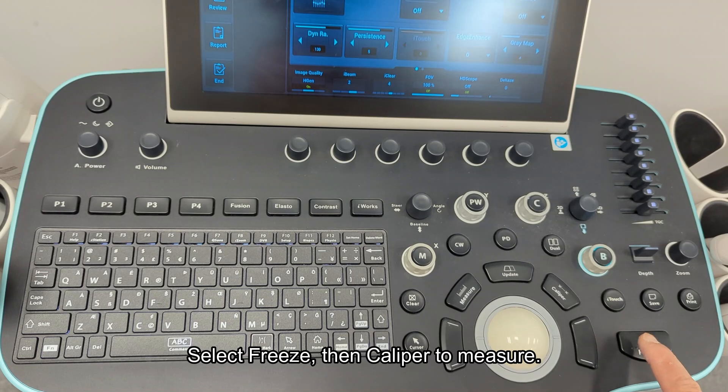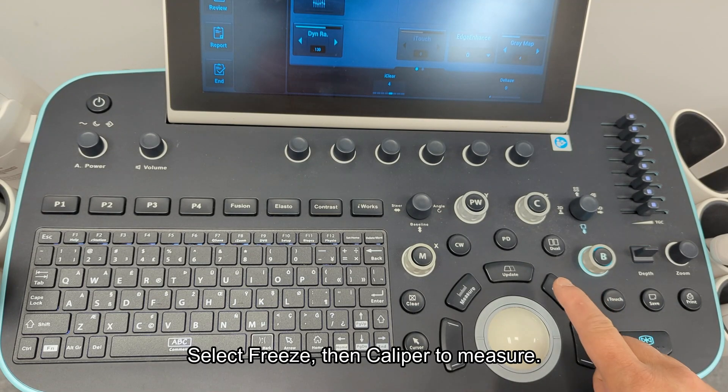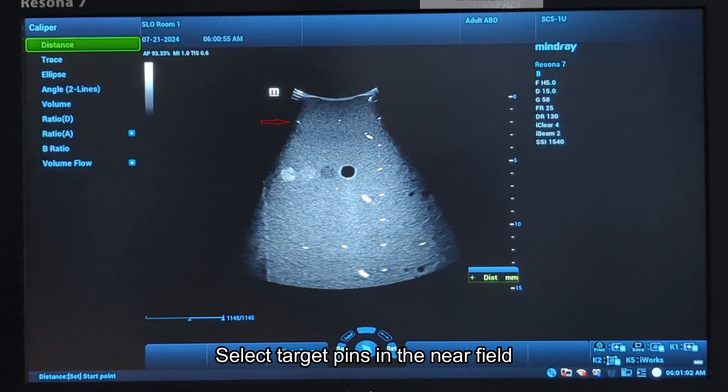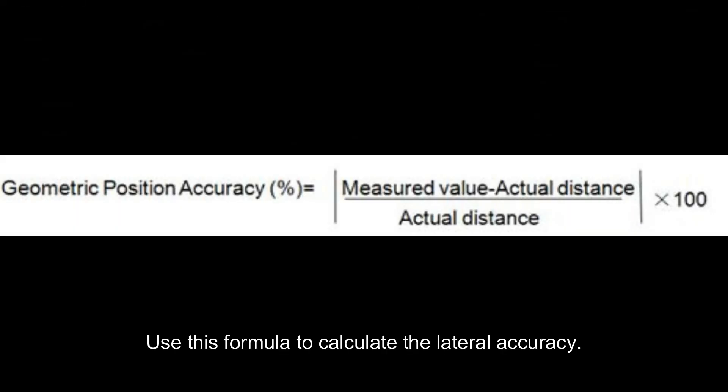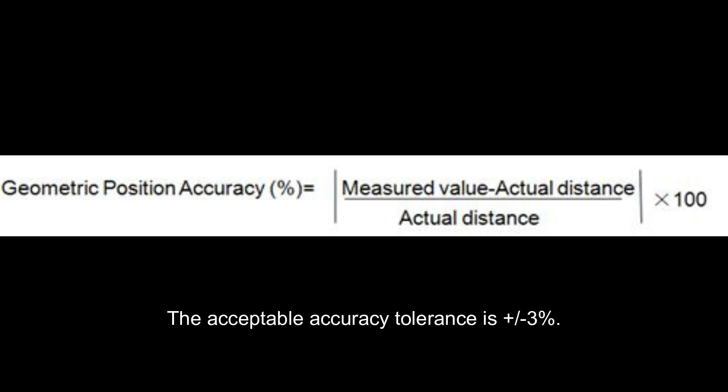Select freeze, then caliper to measure. Select target pins in the near field and measure the distance between two target pins on the transverse target line. Use this formula to calculate the lateral accuracy. The acceptable accuracy tolerance is between plus three to minus three percent.